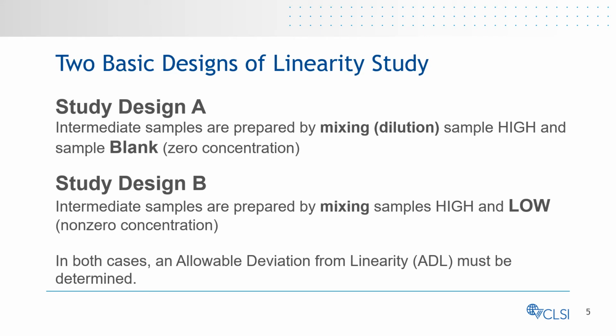For establishing a linearity interval, two different study designs are presented in the new EP06. Study design A mixes a high sample with a blank or zero concentration sample, and study design B mixes high and low samples with no zero level sample.